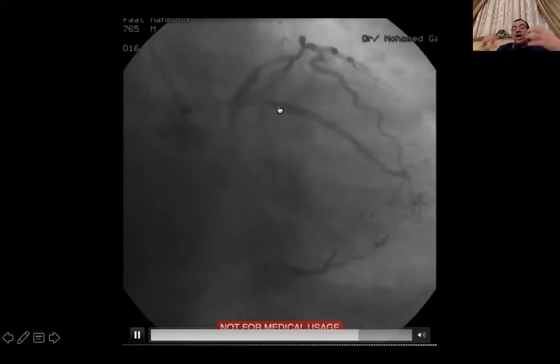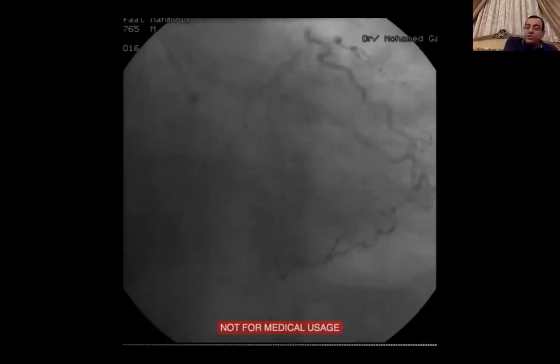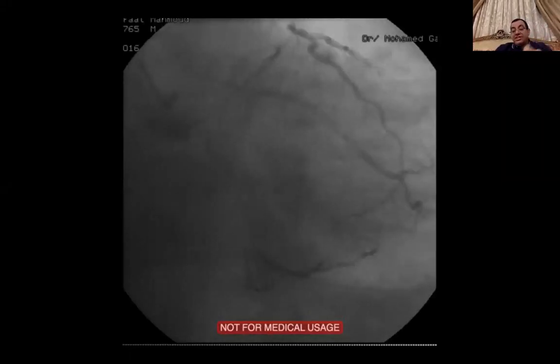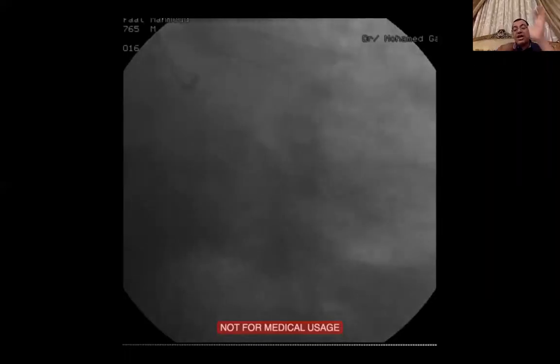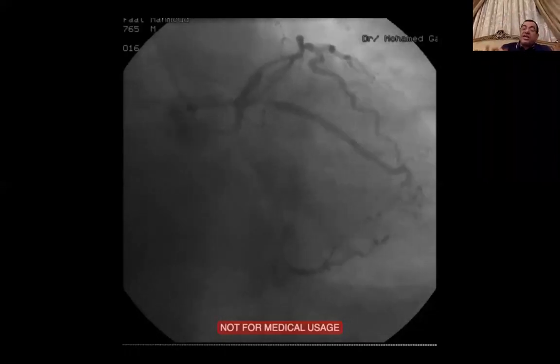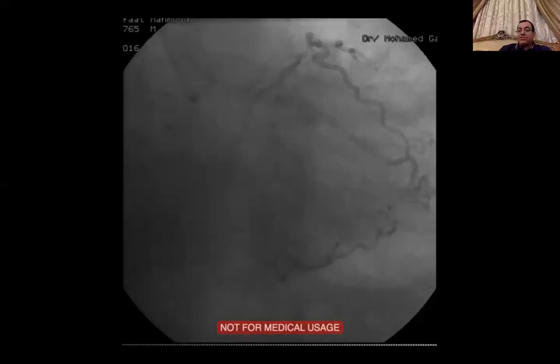So you need a large stent to accommodate the left main, at least 3.5 going up to 4 or 4.5. A 3 millimeter stent can never go to 4 millimeter. You have to use at least 3.5 or 4 millimeter to adapt to the left main. So I prefer to choose the proximal part of the LAD to be with the left main, not with the ramus. This is my answer.